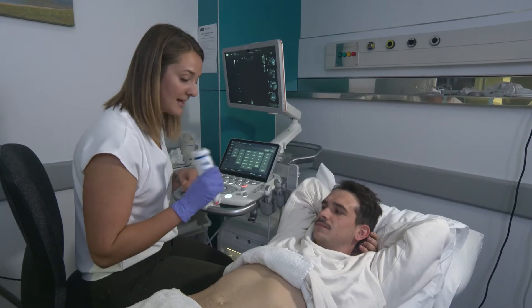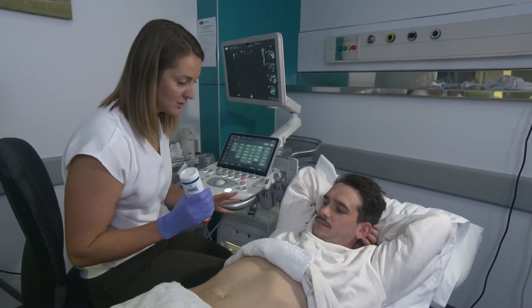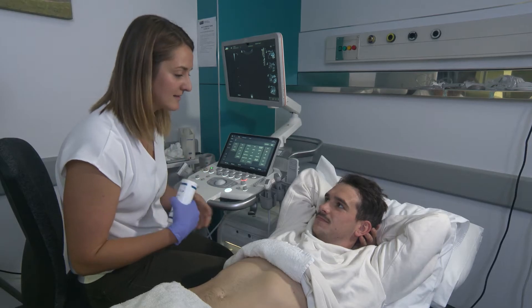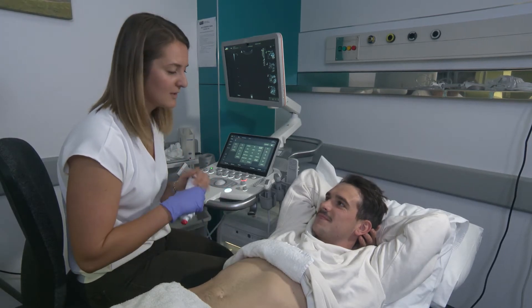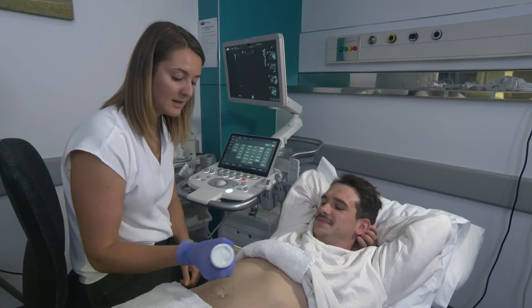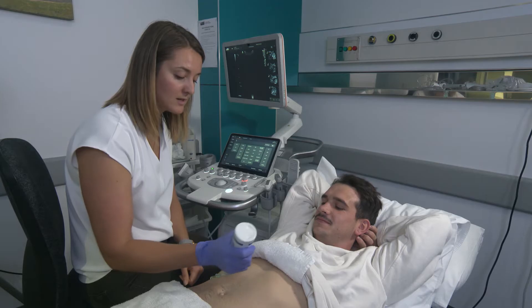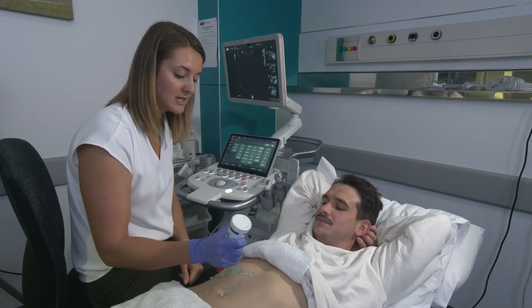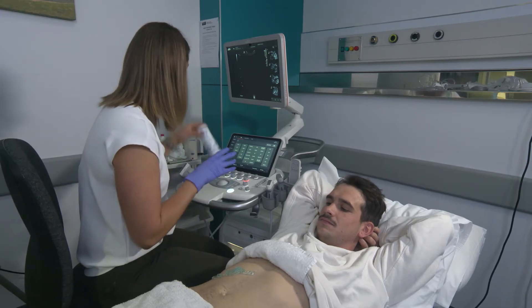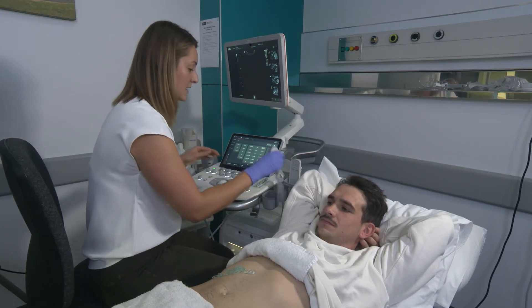We're first going to start by applying some warm gel. The gel should be warm. During the scan I might ask you to take in a few big breaths, I might ask you to roll onto your side. If at any point you're really uncomfortable, just let me know. When we apply the gel, we want to make sure that we are staying away from the patient so that the tip of the gel bottle doesn't touch the patient, and that is for infection control purposes.